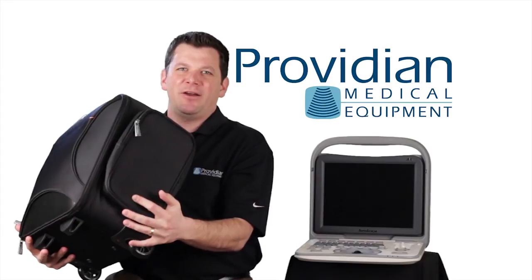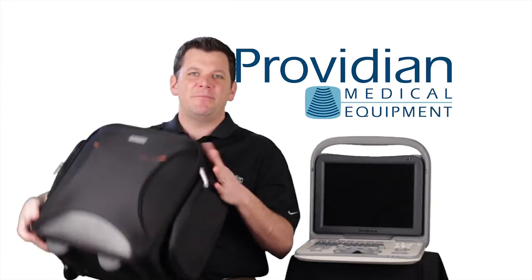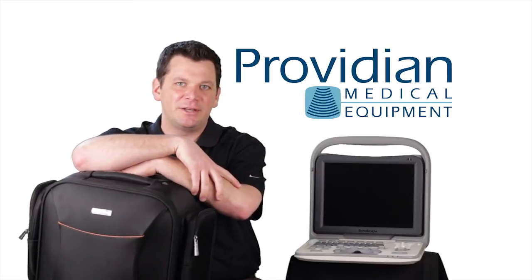It even comes with a carrying case — it's got an extended handle, wheels on the bottom, which makes it real easy to carry the machine around. With the machine being lightweight and the case being lightweight and tough, you can take this wherever you need to go.